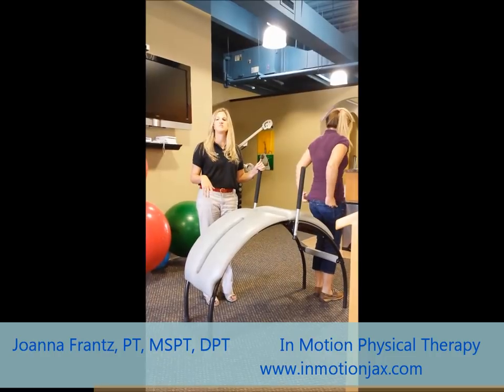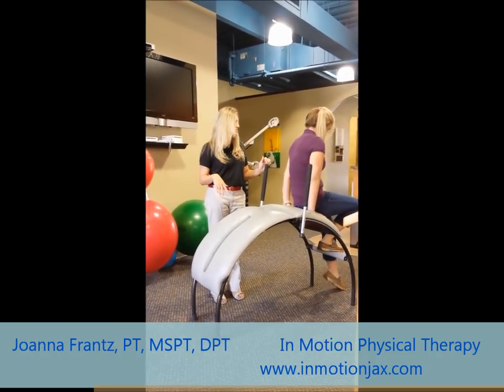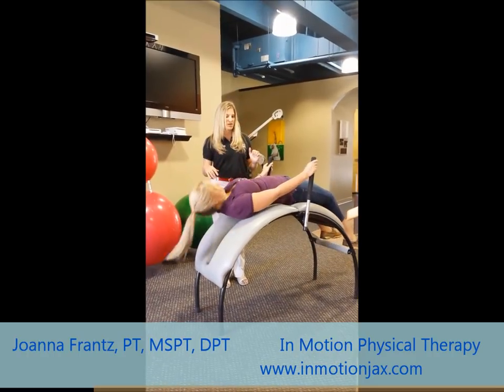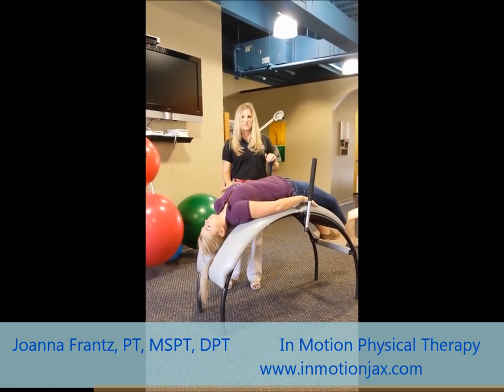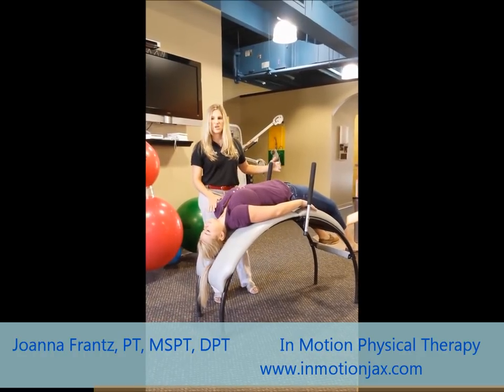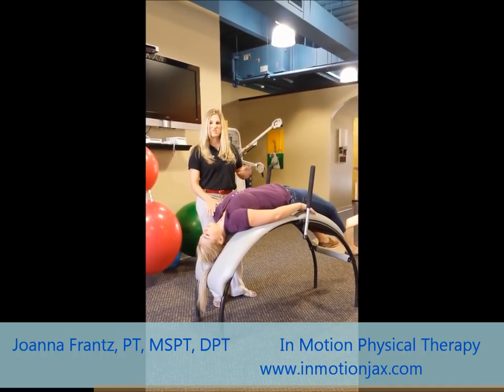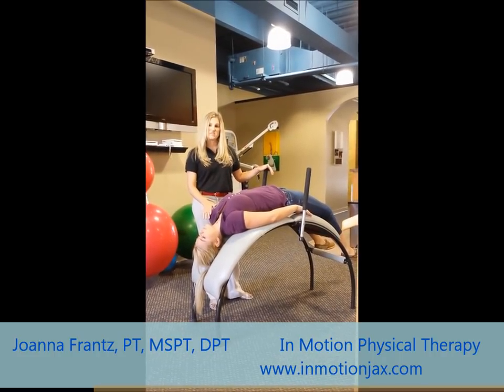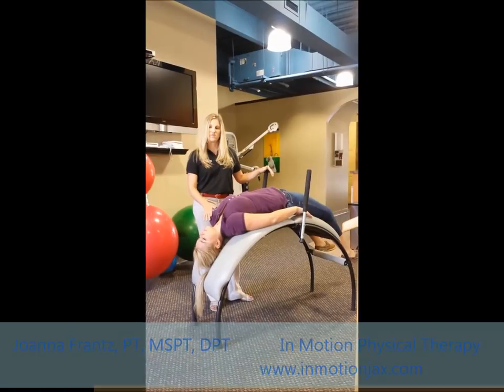And turning around, she can stretch now into extension. Stepping up on the step, holding onto these handles here, and stretching down, keeping her legs straight down on the table, and resting her head and neck back on the table. This stretches the back into extension and can help open up some of the spaces for the nerves and all of your arteries.